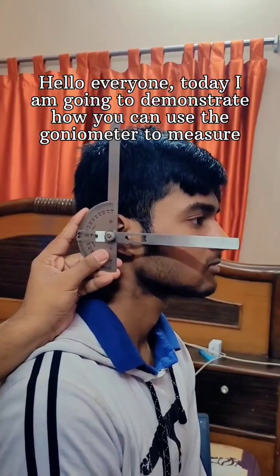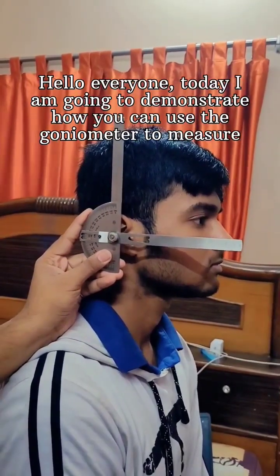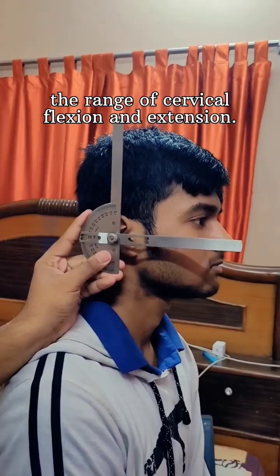Hello everyone, today I am going to demonstrate how you can use the goniometer to measure the range of cervical flexion and extension.